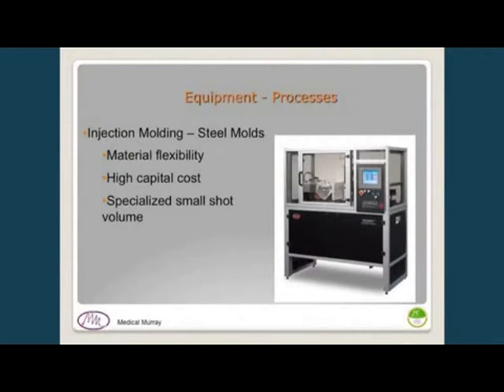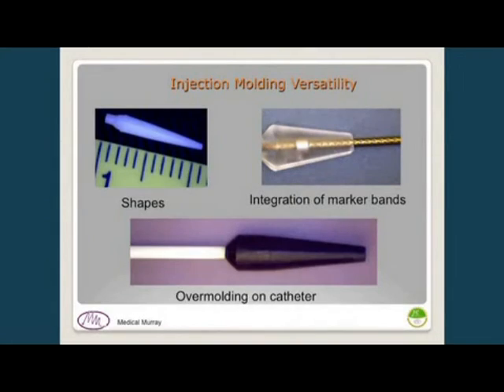We have also developed injection molding of these tips at our company, using a special machine designed for very small shot volumes. It offers high material flexibility and rapid speed, though at high capital cost. Examples shown include a catheter tip about 1.5 millimeters in diameter and about a centimeter long, with molded-in marker bands, or over-molded tips onto catheters in various shapes, demonstrating the versatility of this approach.